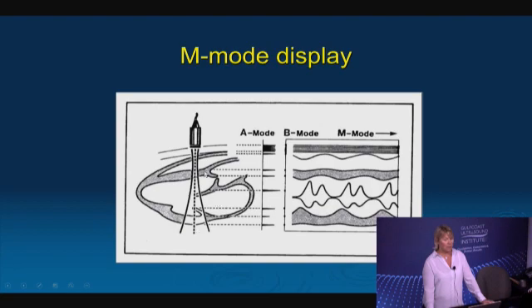In this example, the line is taking one slice through one segment of the right ventricle, the interventricular septum, the left ventricle, the tips of the anterior and posterior mitral leaflets, and the posterior wall. So when I look over at my M mode display, that's what I'm seeing. I'm seeing a fluid-filled right ventricle, solid septum. The backdrop of the white is the left ventricle.